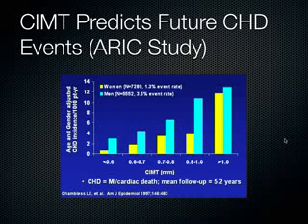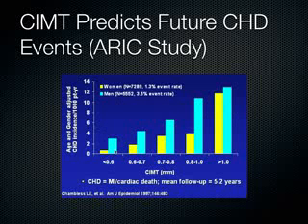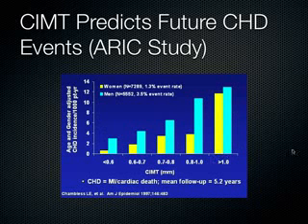And it hasn't really gained a lot of traction because there hasn't been access to ultrasound until very recently. In other words, if you're, let's say, a primary care doctor or a cardiologist, you would have to refer your patient out to get an ultrasound, and then they would come back. And the way this data really works is you do serial ultrasound exams every 3 to 6 months, which really isn't that convenient or feasible to do on a large scale. But they did do it in this study, and they had a lot of patients. You can see the N there is very, very high. It doesn't correlate early on as well in women, but as you get to this larger thickness here, it starts to have a better correlation.